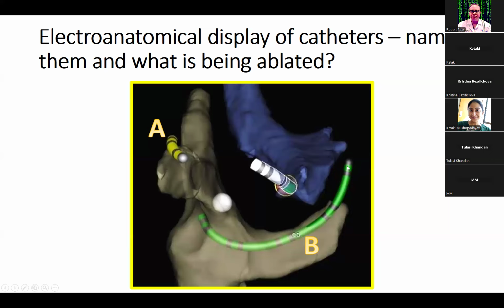So you don't have the guide of a coronary sinus catheter when you're all the way up here, which makes it harder to know, is the pathway here or here or here? And then the other thing that's hard is that it's actually hard to point by point move around this area. It's not impossible with deflectable sheaths and deflectable catheters.